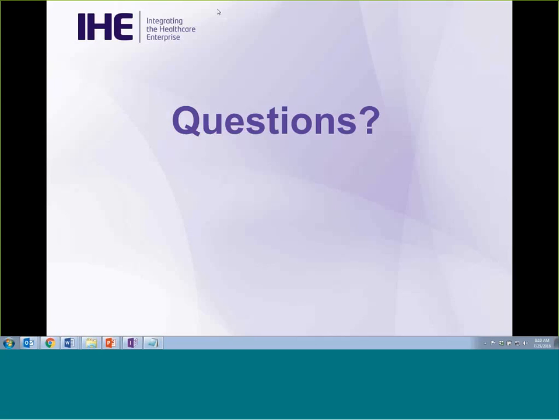I had a question for you, Kevin. Where do you think these watchers will reside? So you had for the remote reporting? Right. So the nice thing is it's all RESTful interfaces. They could reside anywhere that you've got secure access to the server. You can set up a secure link. I'm guessing some of them are going to be dashboards. So if some radiology practice wants to keep tabs on the work flowing through, tapping into this lets them set up a dashboard.